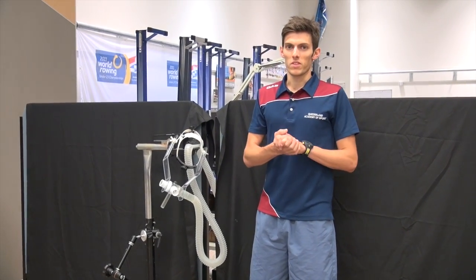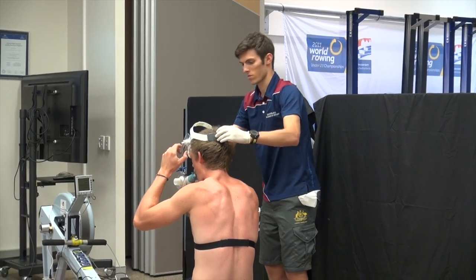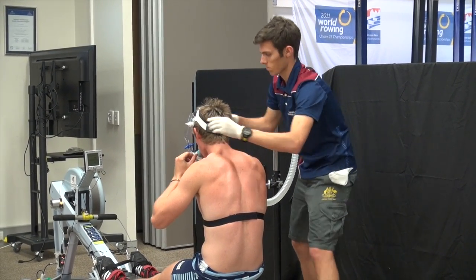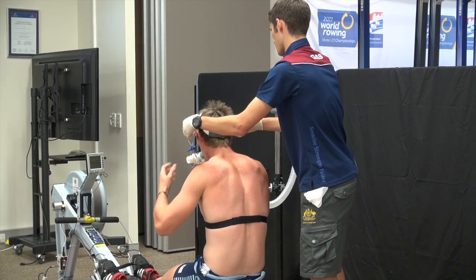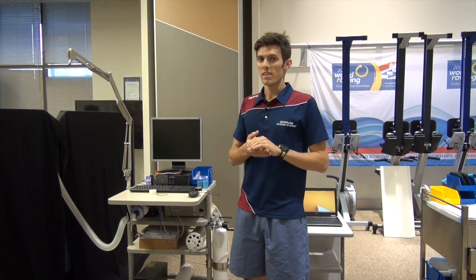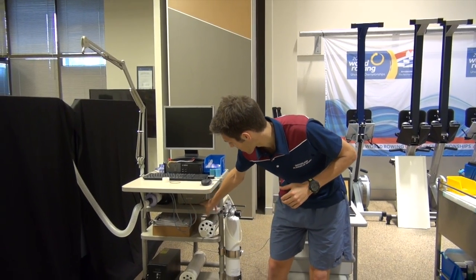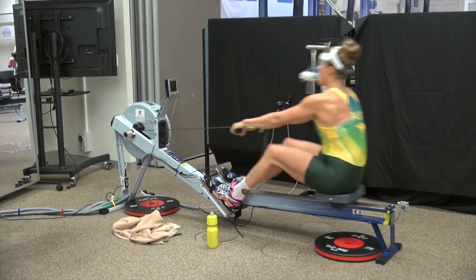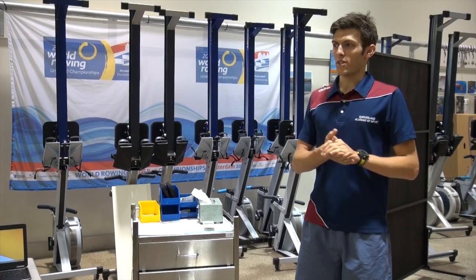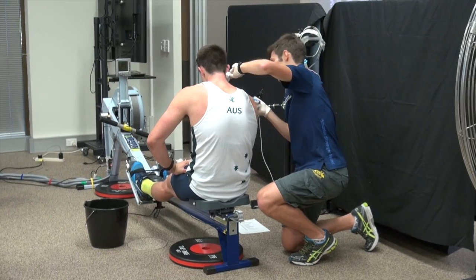While the rowers are doing this testing, they'll be wearing this headpiece which measures their rate of oxygen consumption. During this test, we'll be able to get an idea of the rower's VO2 max, which is a critical factor for being successful in rowing. This here is our metabolic cart, and what that's doing is measuring from the headpiece the concentrations of oxygen and carbon dioxide in the air which the rowers are exhaling. At the end of each piece they do during their testing, we'll get blood lactate samples to get an idea of how hard they're working.